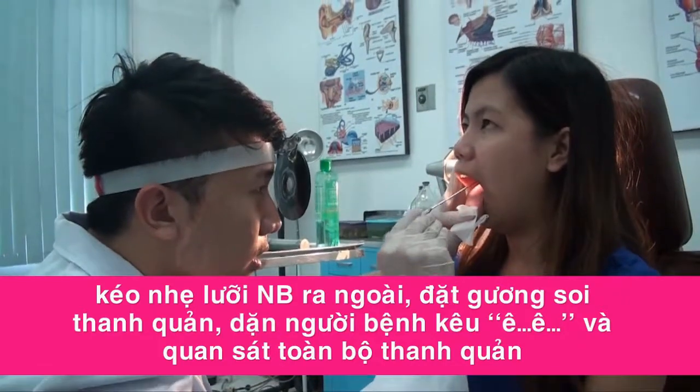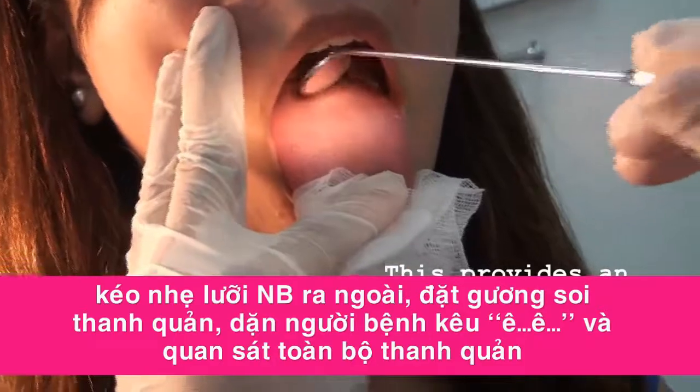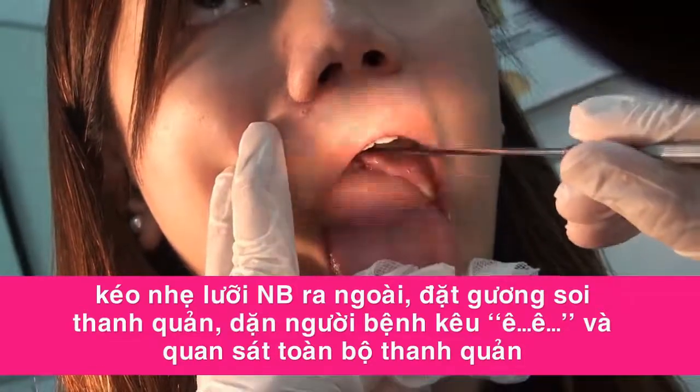Lift the uvula with the back of the mirror, then push it backward and upward. Have the patient say "hee" to assess laryngeal function. Evaluate the tongue base, oropharynx, and hypopharynx.